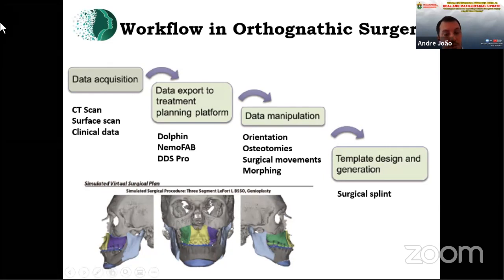Surface scans, I usually use scanners, like an intraoral scanner. And then you take this data into a specific software. This is the most common software that we use in Brazil. I use NemoFab, which is from Nemotech. It was developed by Professor Bill Arnett. Then you put this information together, and then you start to manipulate the data.